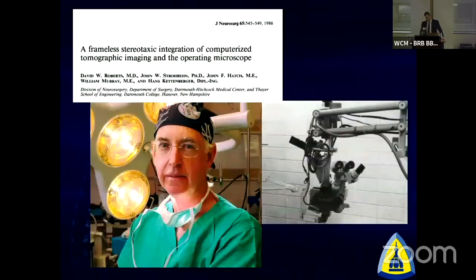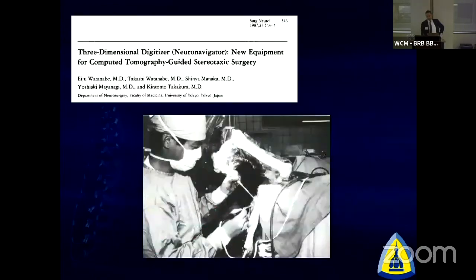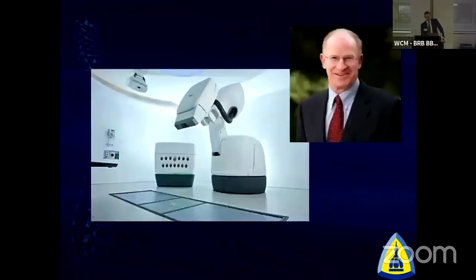The cranial surgeons, for those of you in neurosurgery who know this, this is David Roberts. He was the first to integrate computer navigation with his intraoperative microscope. Similarly, the ISG wand, which came out in 1987, was the prototype for image guidance in spine and cranial surgery. There's really not a single cranial tumor case done anywhere in the United States, at least, that does not utilize this technology for taking out brain tumors. John Adler out of Stanford developed the first completely automated robotic system for neurosurgery and spine surgery. This is the CyberKnife, which has revolutionized the radiosurgery or radiation modality treatment for certain tumors. The problem with this device is you really cannot check the accuracy.